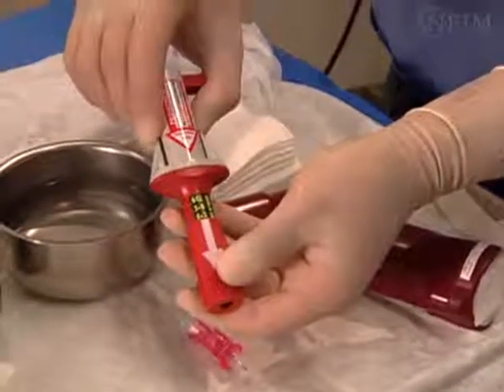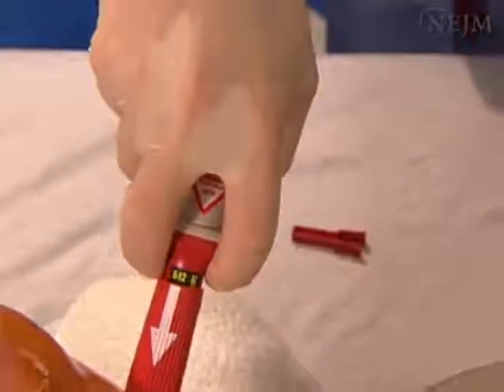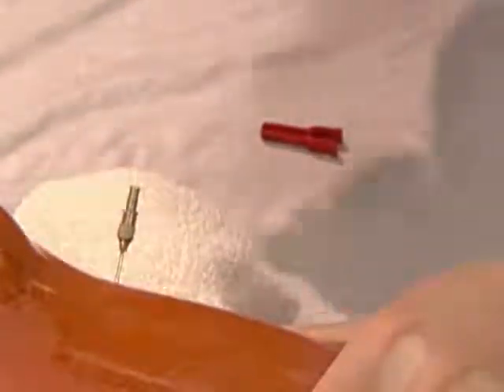With the introduction and availability of power-assisted devices, which greatly facilitate intraosseous placement, guidelines now support the use of intraosseous access in patients of all ages.